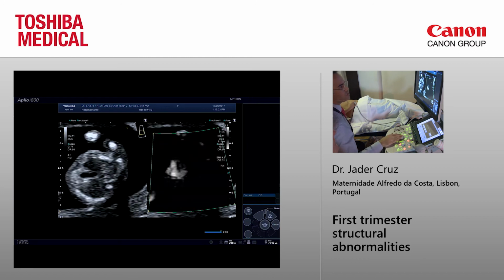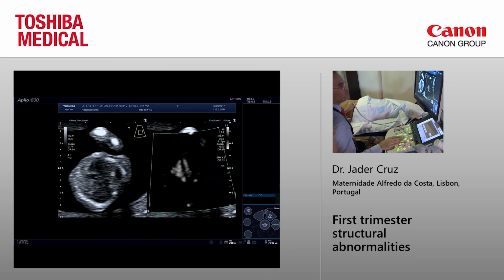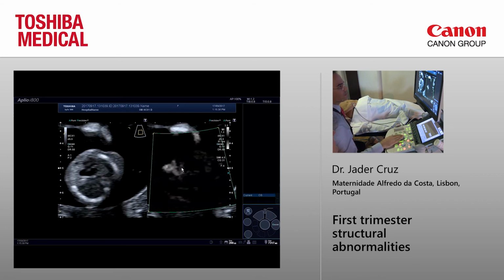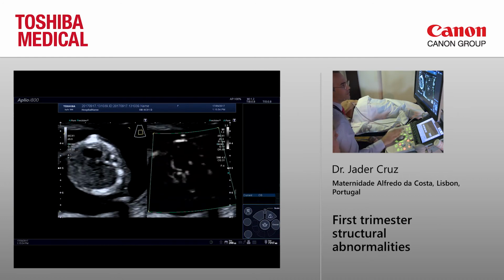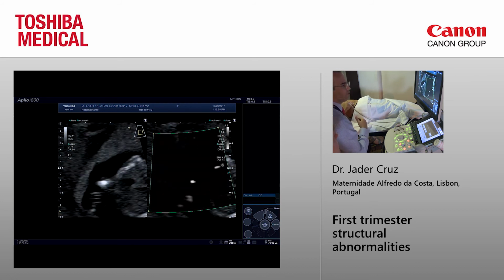You can also see something that we have in the next phase of the study. You can see the pulmonary veins, which is very hard to see usually in the first trimester. And then you move on to the outflow tracts, and you see the aorta right there. That's the beginning of the aorta, and you have a clear and intact connection to the left ventricle. That's very nice for heart assessment. And then now the baby just went completely mad.